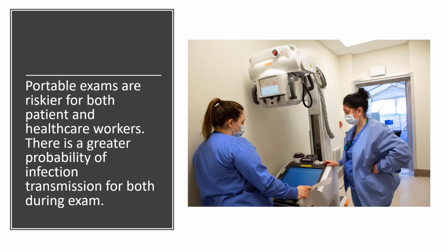There is a complete different methodology in how to dress specifically for each and every patient. There is a difference in the equipment going from room to room to room. During film screen, we're supposed to clean the portable in between each and every examination. To be truthful, we hardly ever did unless it was like a hazardous area, a restricted area because of Ebola or something like that. But today, with COVID, it makes a big difference.